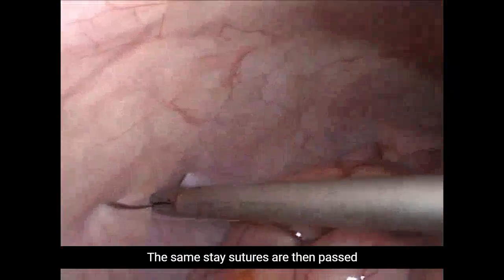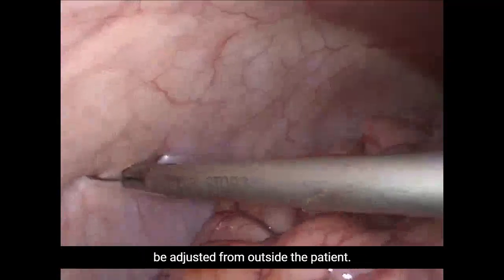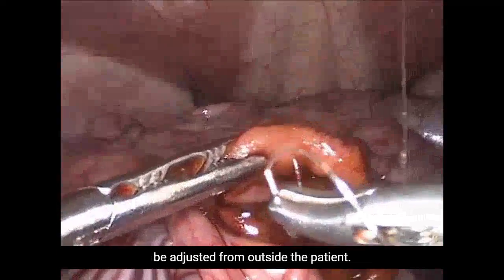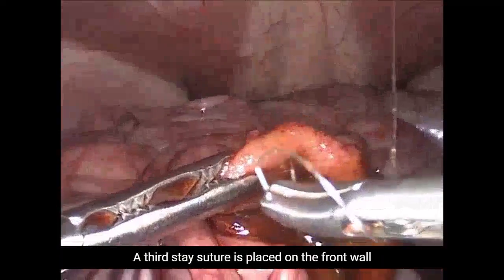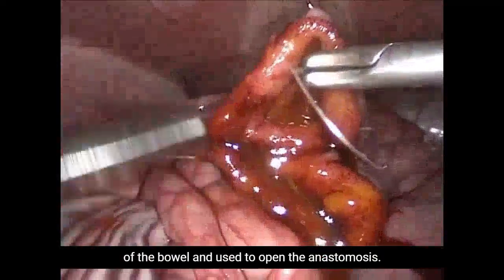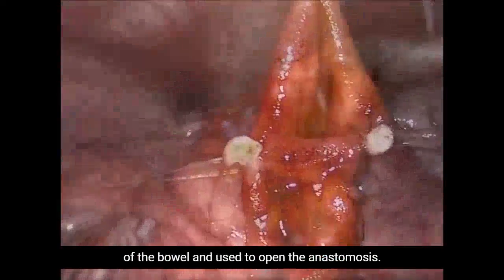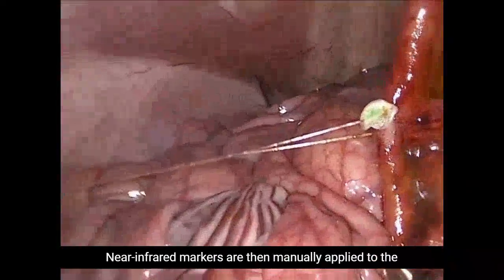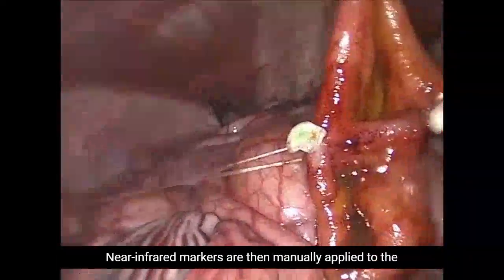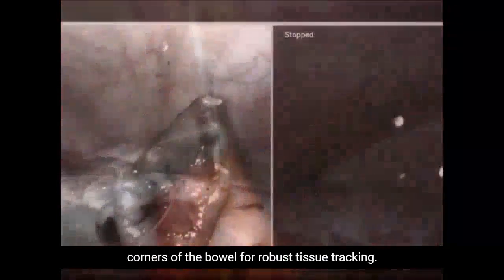The same stay sutures are then passed through the abdominal wall so tension can be adjusted from outside the patient. A third stay suture is placed on the front wall of the bowel and used to open the anastomosis. Near-infrared markers are then manually applied to the corners of the bowel for robust tissue tracking.